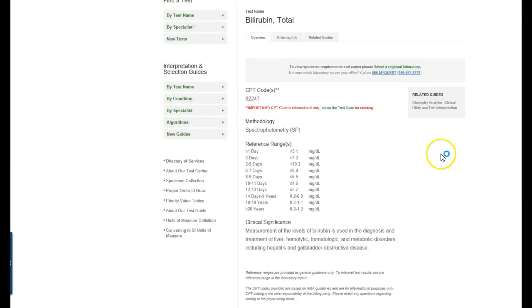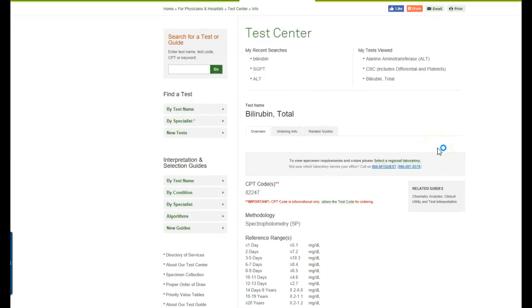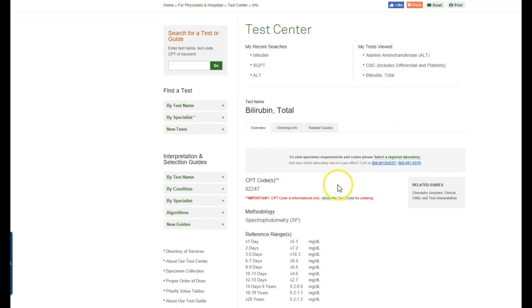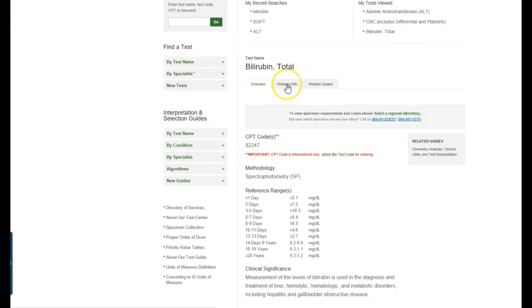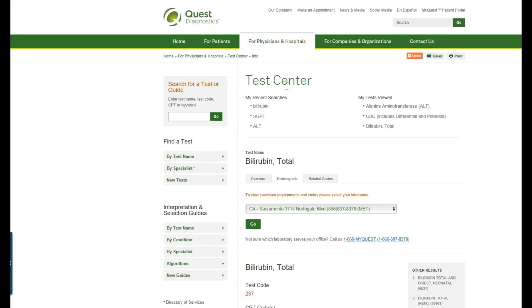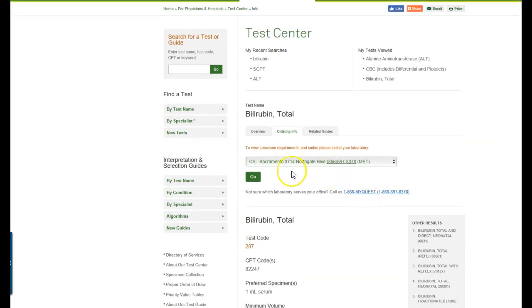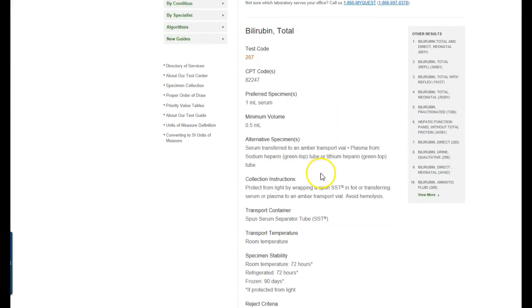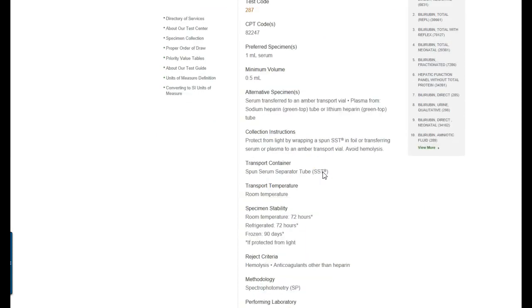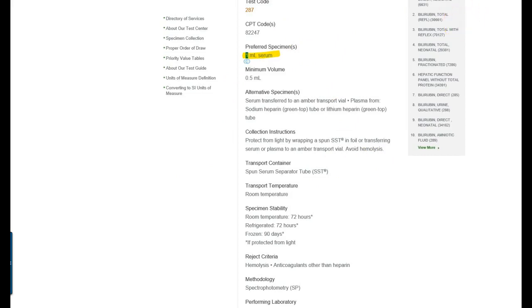And we're back. So we've got the bilirubin total brought up here and again we're going to go to ordering info. If it prompts you to select your location then you want to select the regional lab that is closest to you. Again here I've already pre-selected the Sacramento lab. So in looking at a total bilirubin if I want to know what tube color I look and I find that it says one ml serum here and so I know that that means that I need to have red or SST.